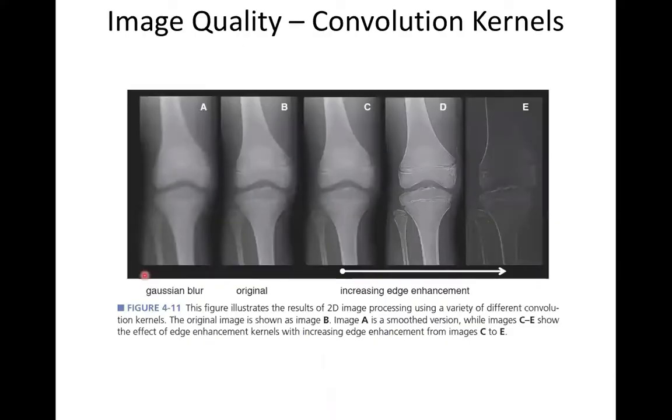So let's look at the effect of some of these filters and convolutions on a medical image. Here's an X-ray image. This is just a plain film X-ray image of somebody's knee. And the original picture looks like this. If we convolve this, say with a smoothing function like that Gaussian, we get a blurry version of this picture. And so random noise in the background goes down, but you can see also the edge detail here gets blurred out, and the edge detail up here gets blurred out.